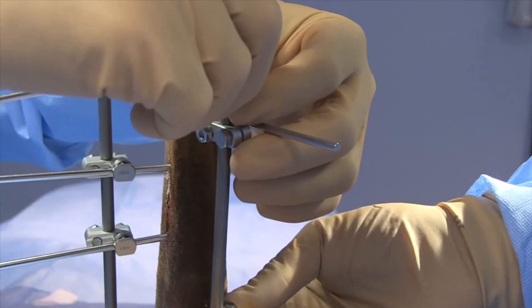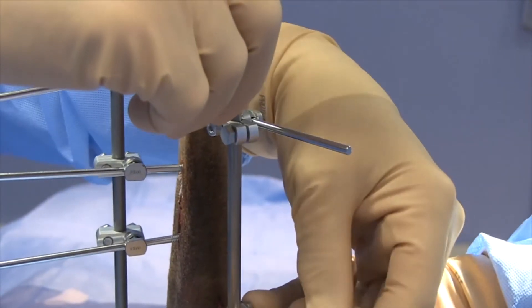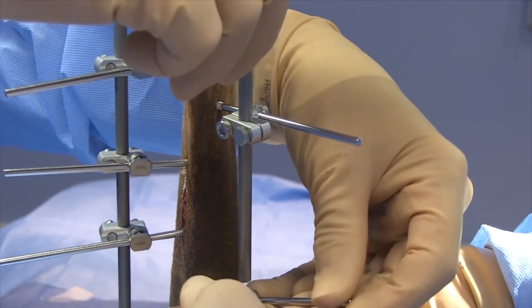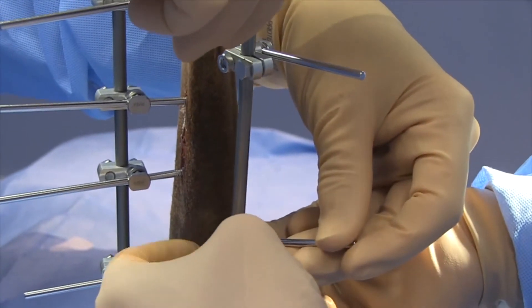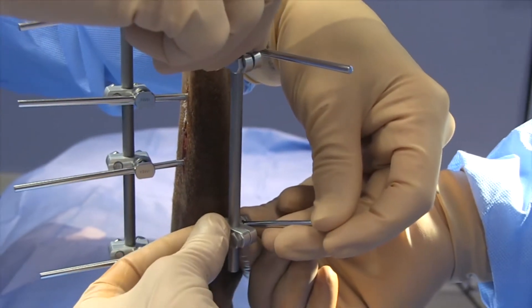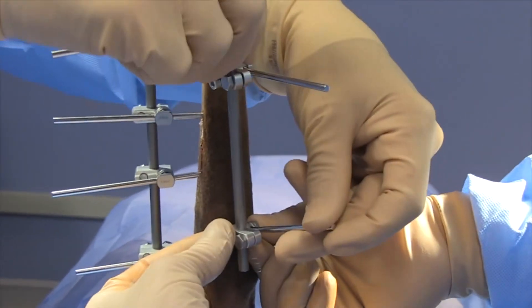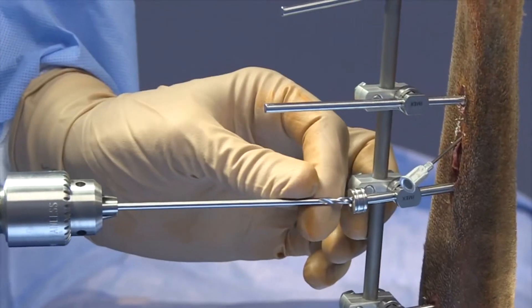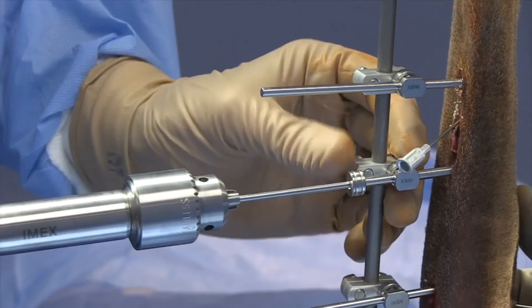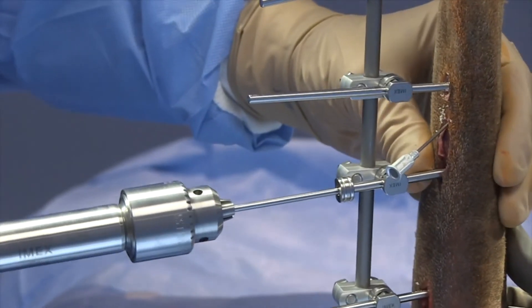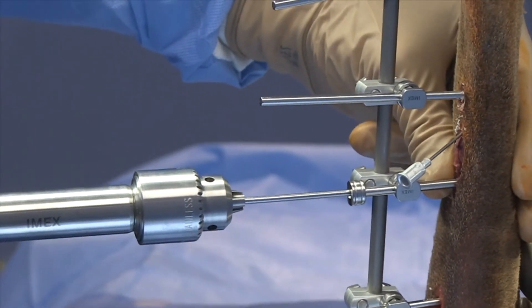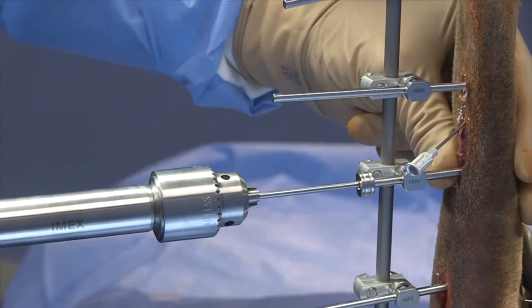The secondary bolt is designed to free the surgeon's hands and simplify frame application. In addition to providing symmetrical tightening of the SK clamp, the secondary bolt also enables an empty clamp to serve as a targeting device. This design eliminates the need for expensive aiming devices and pin placement instrumentation.